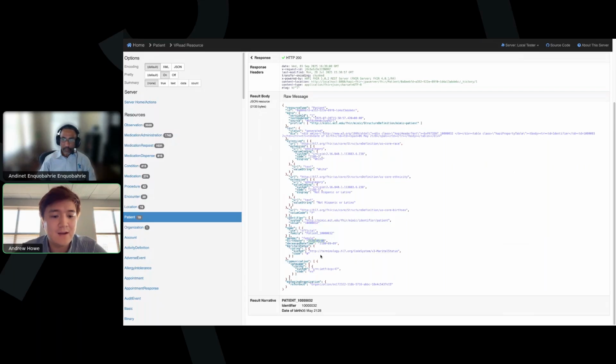So they've anonymized it. But anyway, I just want to show here that this is a FHIR server that we're running, but you can substitute this with an EHR system, or even there are some providers, like AWS has HealthLake, for instance, which has a similar implementation here. And this can be run on the cloud, or it can be run locally. In this case, it's being run locally on our intranet. So we have a server that's running on our own intranet, and right now I'm just interfacing with that server. Now I'm going to show a different one. I'm going to show the Orthanc real quick.